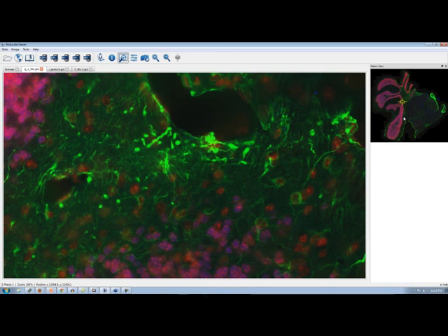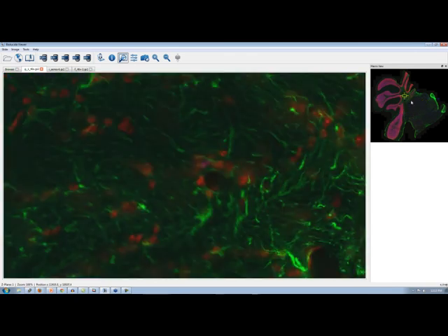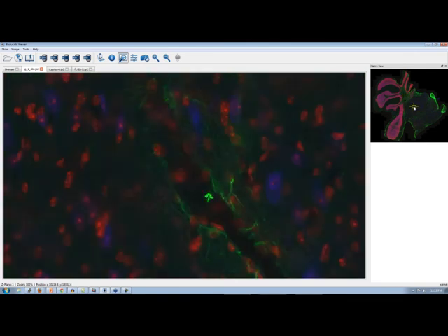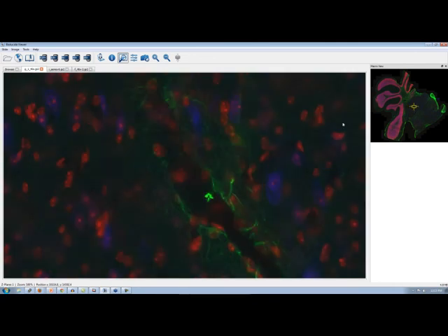So as we said, we've so far shown three different ways that you can zoom in the viewer. Let's quickly show the other two, panning and focusing. For panning, it's really straightforward. Anyone who's used Neurolucida or Stereo Investigator knows this method. If you click anywhere in the macro view, you will automatically zoom to that region. If you keep an eye on the macro view, you can see a tiny box, which is the region that we're currently looking at.